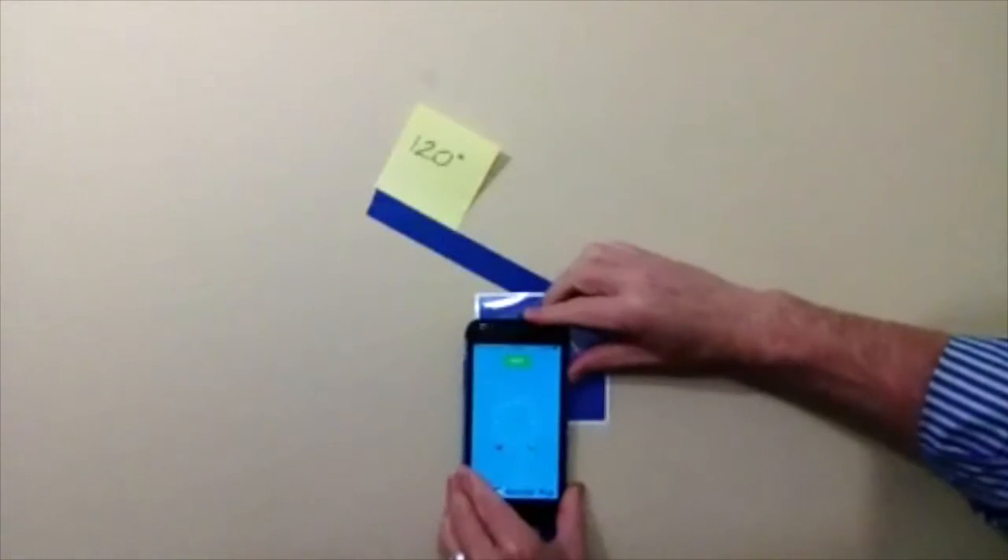I take the RateFast Goniometer on the phone and I hit start. The reference is automatically set to zero degrees. I then rotate the phone until I reach the terminal of my endpoint, which is 120 degrees. I hit the stop button. Final read, 120 degrees.